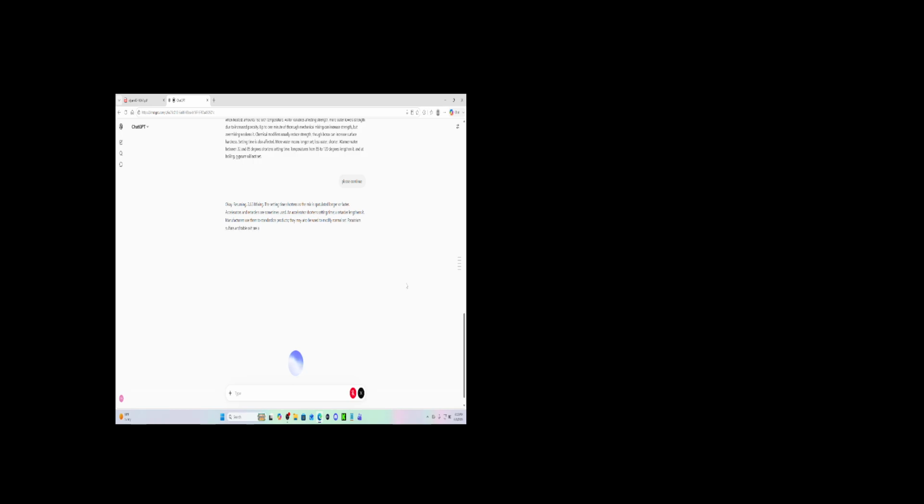Potassium sulfate and table salt are accelerators. Vinegar, potassium citrate, and borax are retarders. However, these chemicals also reduce setting expansion and strength. So never use them with casting or soldering investments. Adjust water temperature and mixing instead. One acceptable exception is slurry water for mounting casts, a concentrated suspension of gypsum particles that greatly accelerates set.